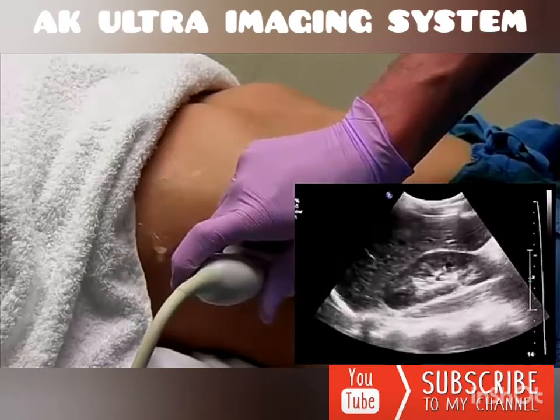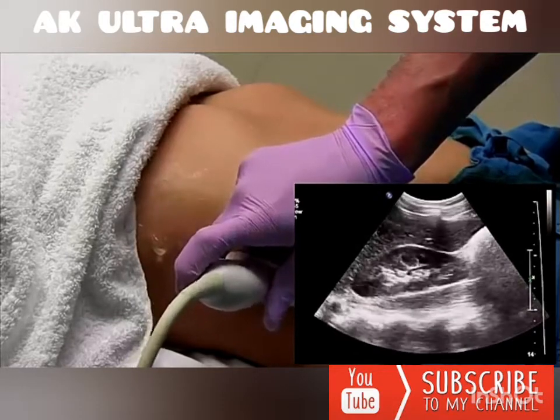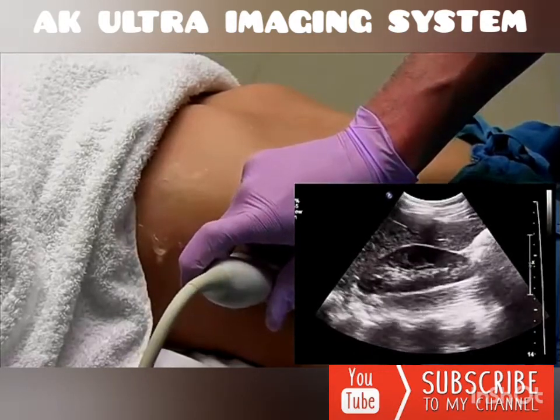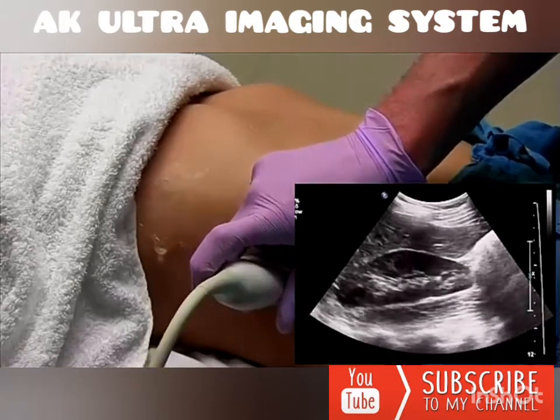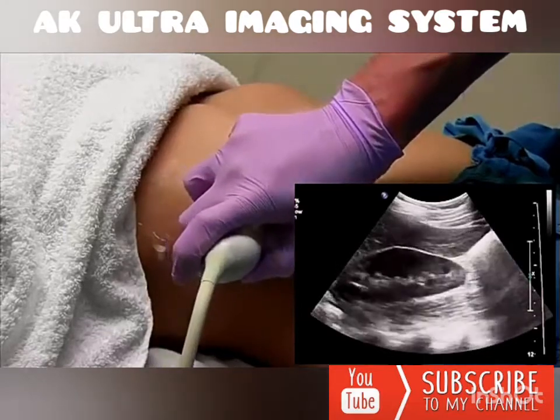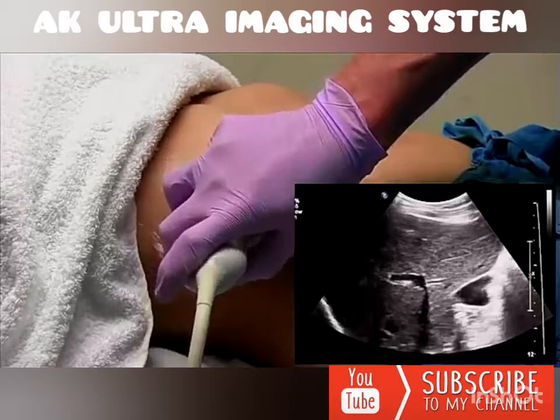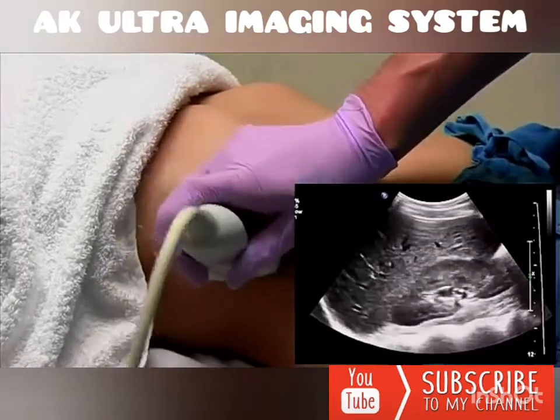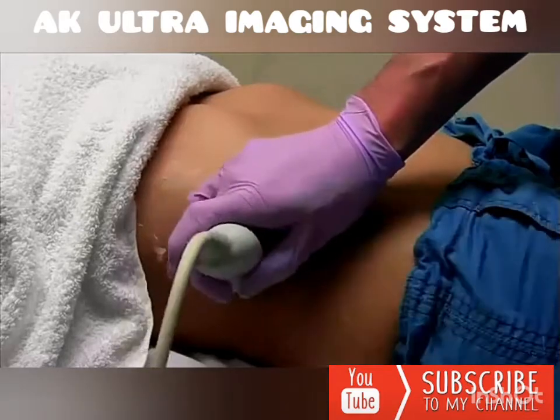And then as you turn coronal, you'll be able to evaluate if there's any liver enlargement. The right kidney and the liver tip should both end at about the same spot. The whole time you're going to want to make sure that you're sweeping through the liver completely, just again to make sure you're not missing any pathology here.